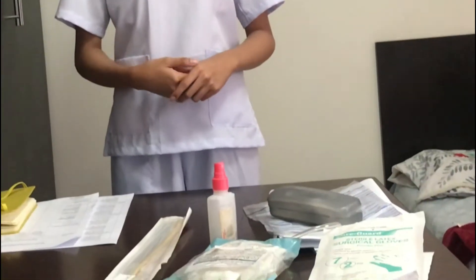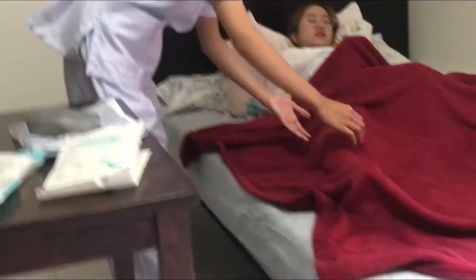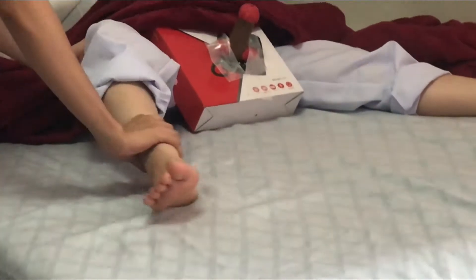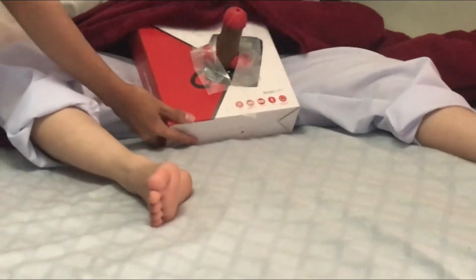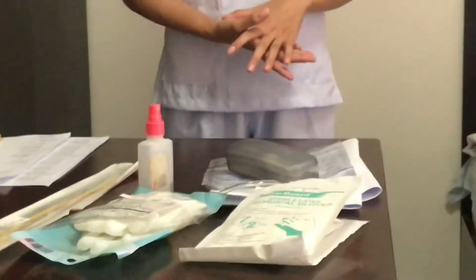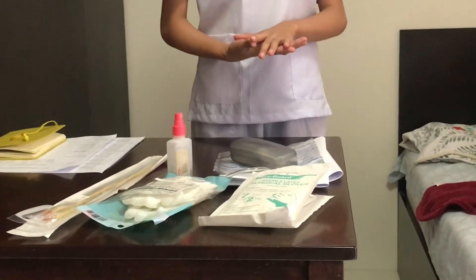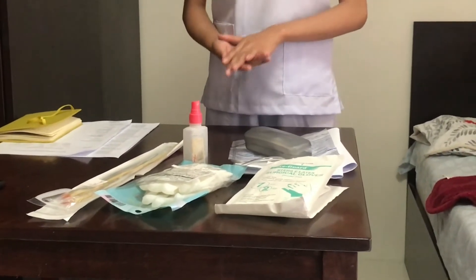In dripping the patient, open the sterile catheterization kit and position the client. Next, put on sterile gloves and drape the patient. Place the underpad and position the fenestrated drape over the penis. Here are the catheter kit contents.